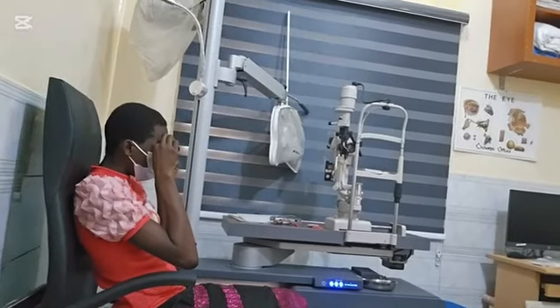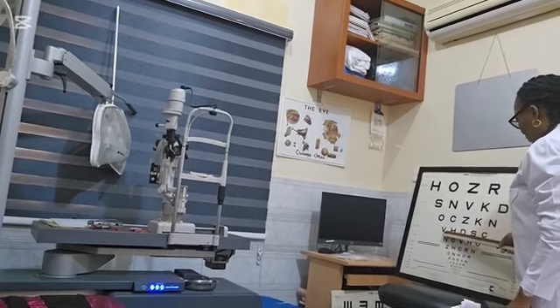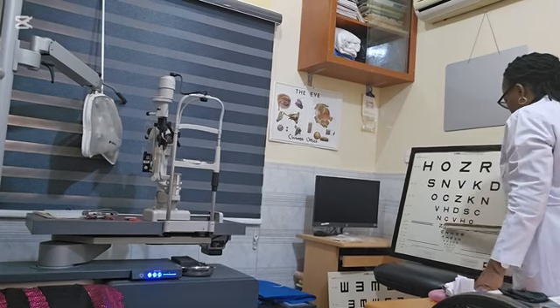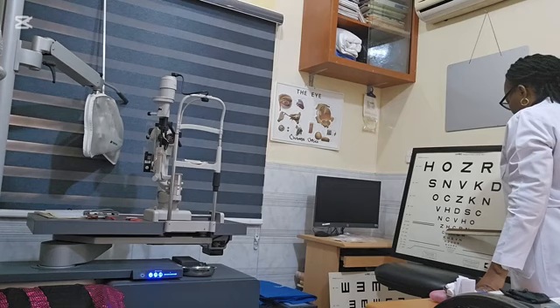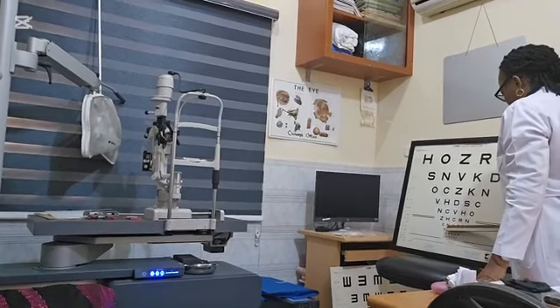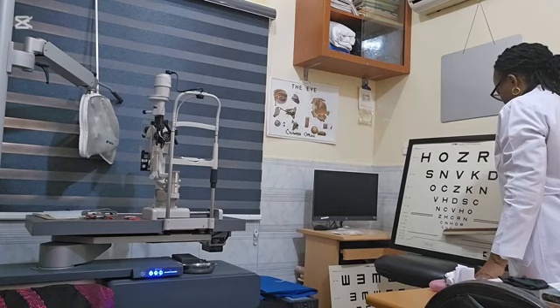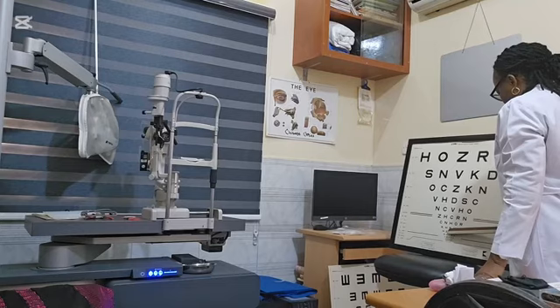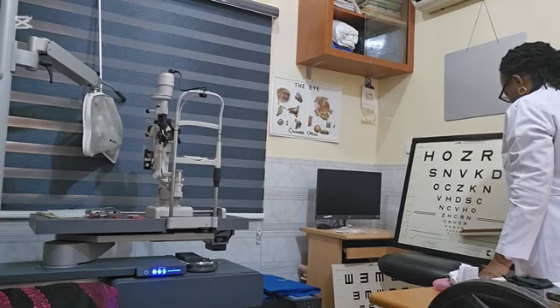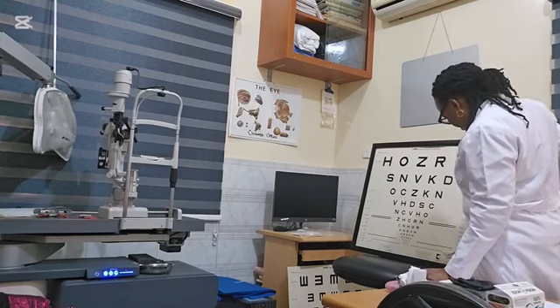O, C Z, K, V, H N O Z, H O, O N H D, X, H, C, O, N. So with the 5x monocular telescope, she was able to read 0.1 logMAR.